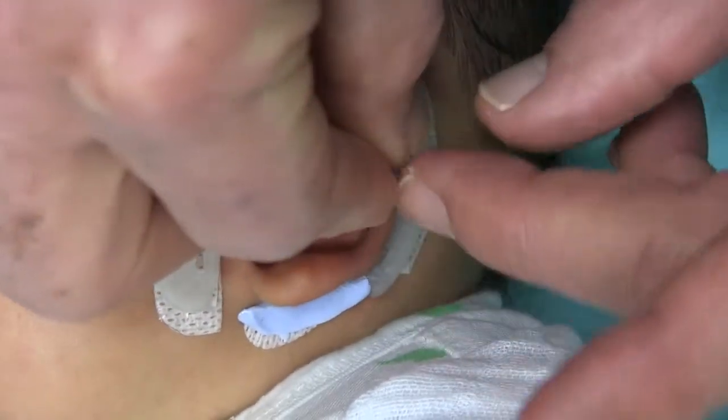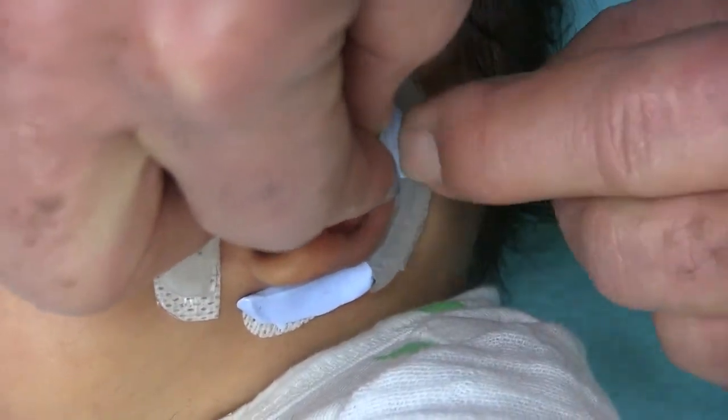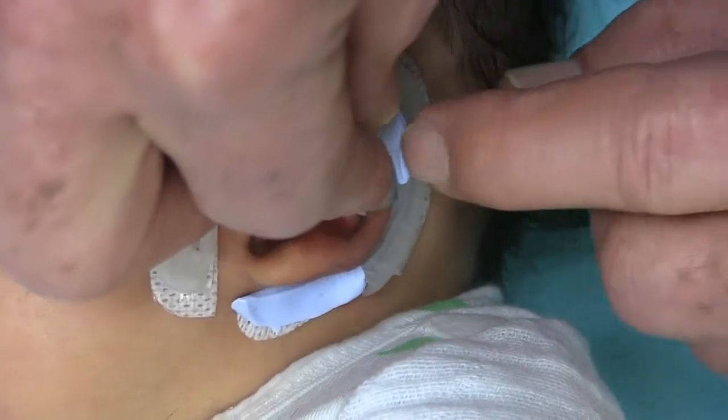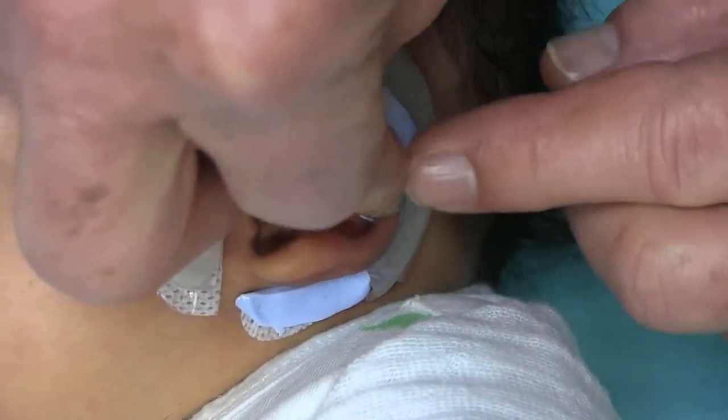This might be too firm of a mix. It's starting to really set up. I can mix some more if you like. Yeah, I'm going to have to add some more. I think we're going to have to get some fresh. Good job, buddy.